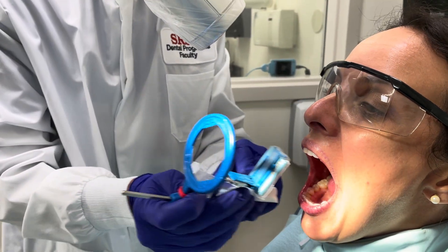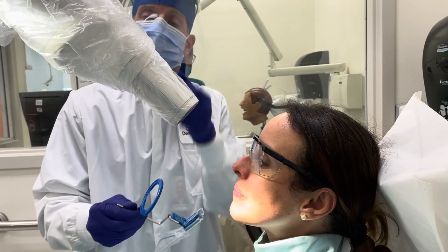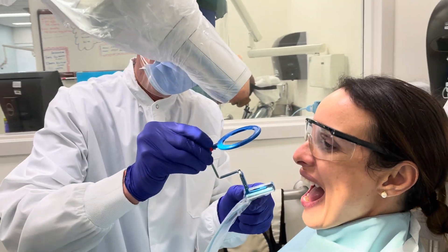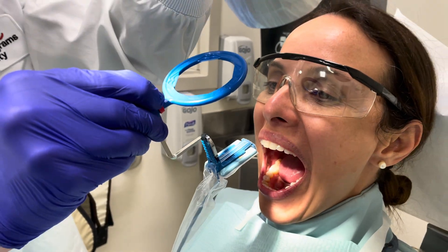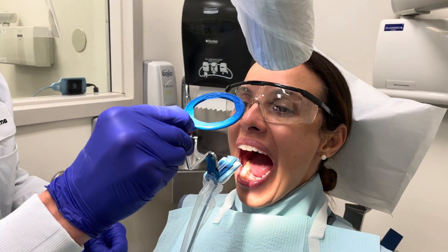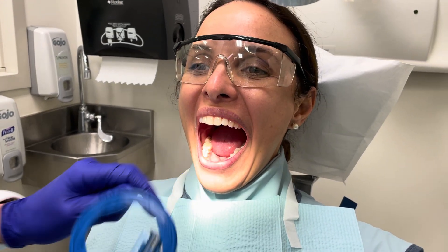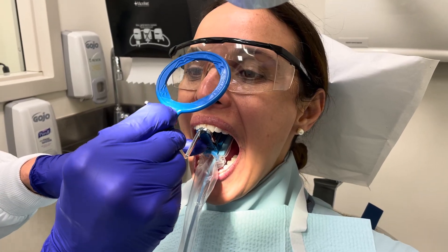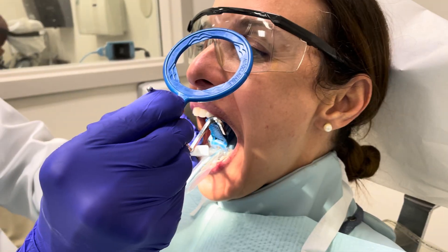If we were to do maxillary canines, I would start in the same way that I started with the maxillary central. I'd come in like this. We'd set up on the left side here. We're going to break this contact right there, coming straight, doing exactly what I did before, but now sliding over, getting my cotton in.